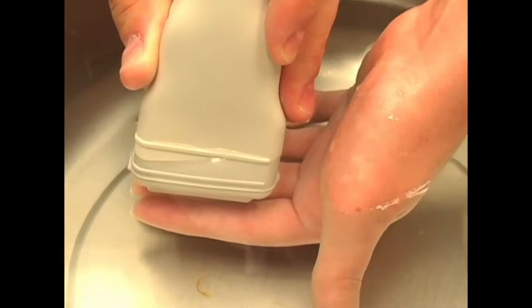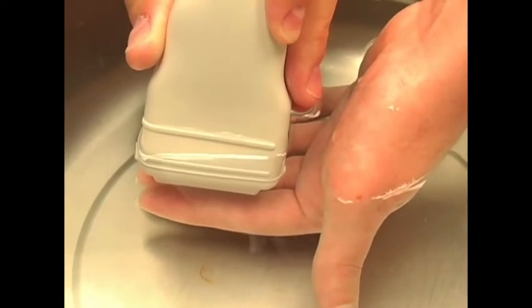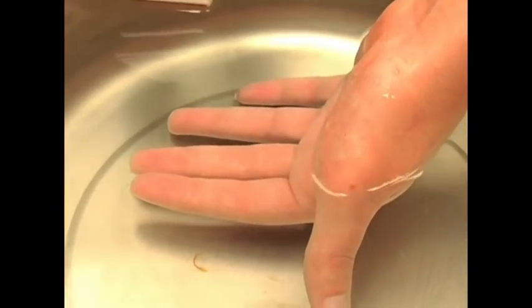Coming back to our finger in the water bath, as you recall, we couldn't see beyond the bones because of the heavy shadowing. So if we want to see the structures in the dorsal aspect of the hand, we have to rotate it in the water bath and reposition the transducer.